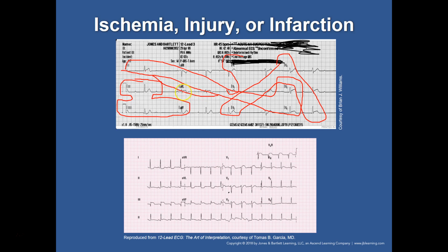But we go into L, obviously have some ST elevation there. ST elevation here as well. So we know we have some lateral wall involvement. This is your high wall and your lower wall of lateral wall. So it appears that we've got involvement throughout everywhere. If you remember back to your reciprocal leads, for our lateral leads we need to have 2 or more of those contiguous leads to confirm or verify. We've got elevation in all 4 of these leads.